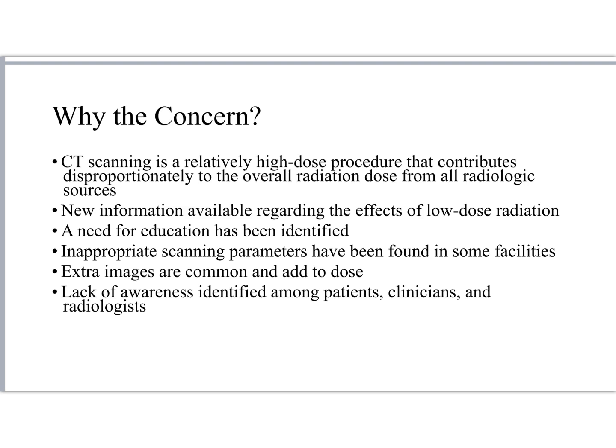Well, why all the concern? Again, this goes back to NCRP report 160, when we found that patient exposure was significantly increased with the advent of CT scanning, and CT scanning continues to lead the charge in terms of overexposing patients to radiation. So this is contributing to a disproportionate overall radiation dose from radiologic sources.